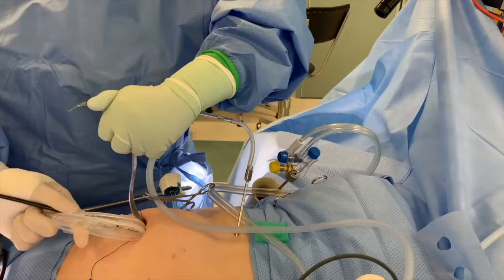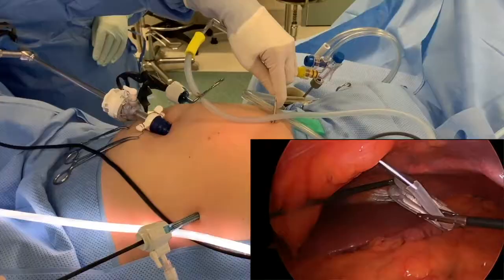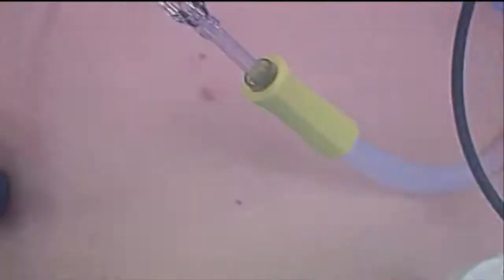In this example, the Livac connector has not been separated. Insert the Livac retractor through the 12mm port wound. The port has also been placed in the epigastrium, in this case, as the patient had both fundoplication and a cholecystectomy.